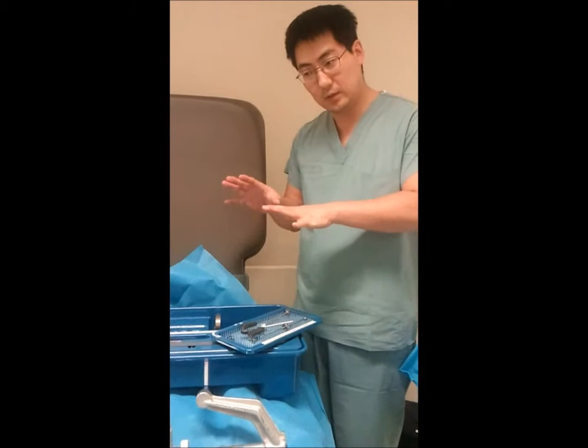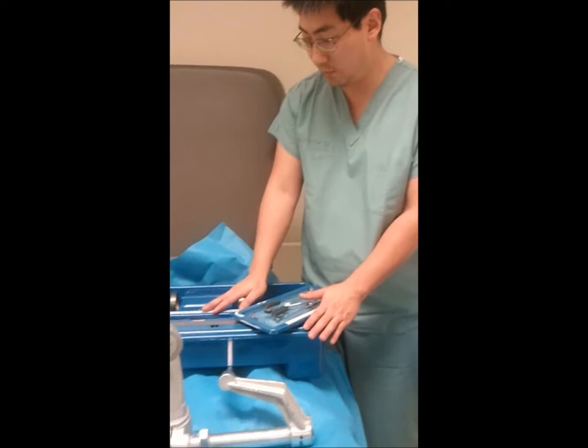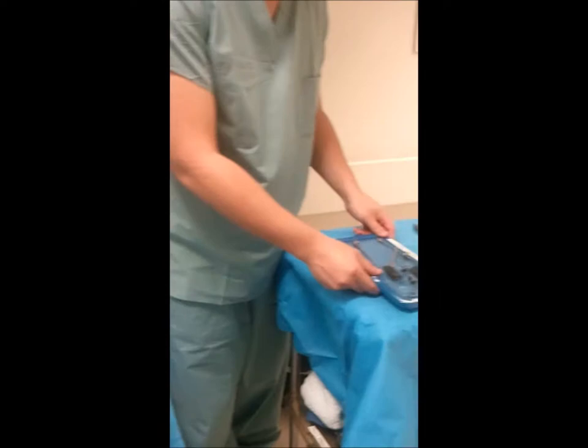Hello again from Dallas, Texas. Dr. Albert Lee. We're going to go through some of the equipment that is going to be in the OR, hopefully all assembled and laid out for you before the patient comes into the room. The first thing I'd like to go through — and all this equipment should be sterile coming out — is the Solomon Twist Drill Kit.